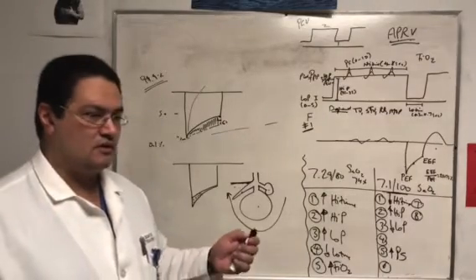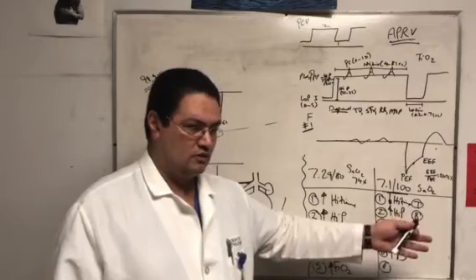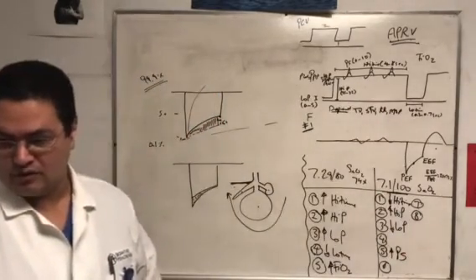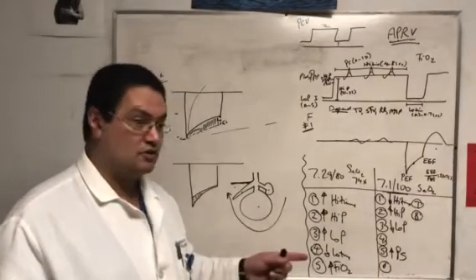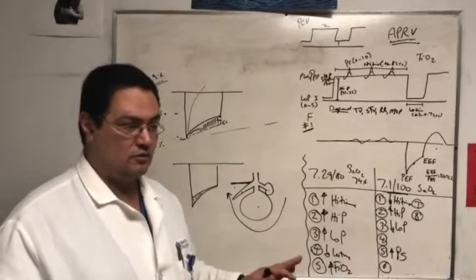So that's why there's a fear that if we add pressure support to the mode of ventilation, we might negate that benefit, because we're giving a positive pressure to a negative pressure breath, right? So we might negate this. That's why people are moving away. That's why pressure support is always 0 in this and in BILEVEL, always 0, the pressure support.